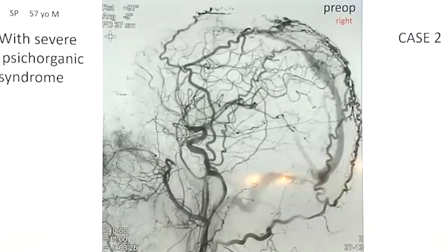This is the next patient. Interesting for dural fistula, very typical is occlusion of the sinus. We see this occlusion of the sinus many times: sinus rectus, sinus transversus and sagittal sinus. But interesting, why do you see it? It is a convexital dural fistula, but closure of the transversus sinus on two sides. For me, it's not very understandable why, but in situations with a big intracranial cerebral AVM, this does not happen. It happens only in situations with dural fistula.